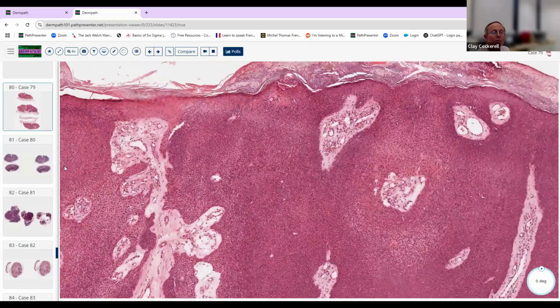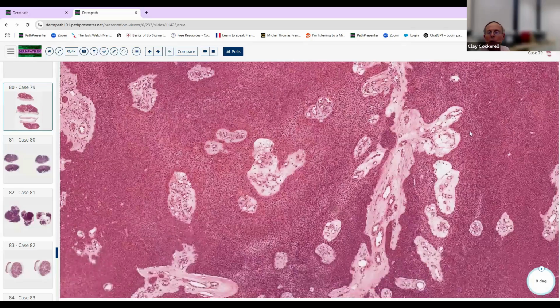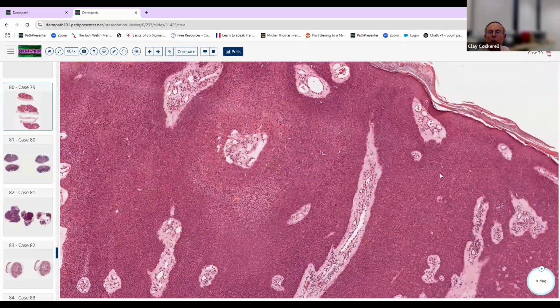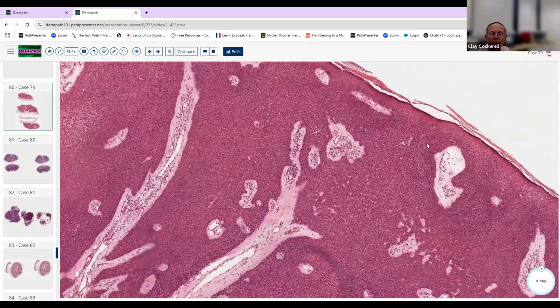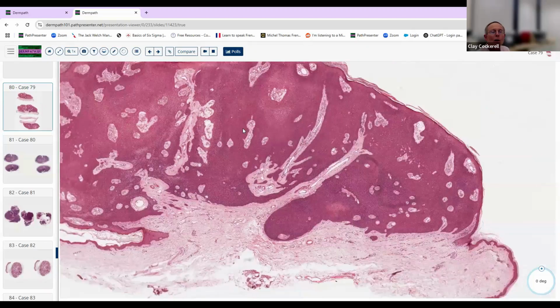that you can see. The name of one tumor escapes me. It's listed as a choice there. Anyway, that's another one that you see: poroid hidradenoma, hidroacanthoma simplex, poroma, and the other one that I'm not remembering right now. So anyway, those are the poroid lesions that you need to know.